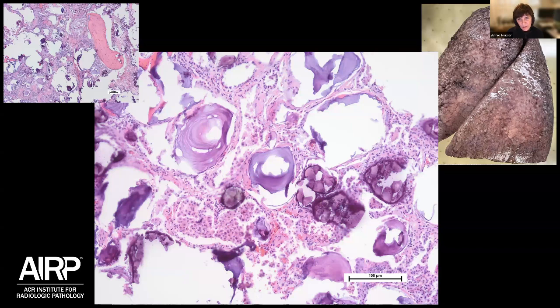These are actually called microliths. They are a combination of calcium and lamellated material that is also a mixture of phosphate. These are called pulmonary alveolar microliths that are dotted throughout this lung, and there's a lot of evidence of superimposed chronic lung inflammation.